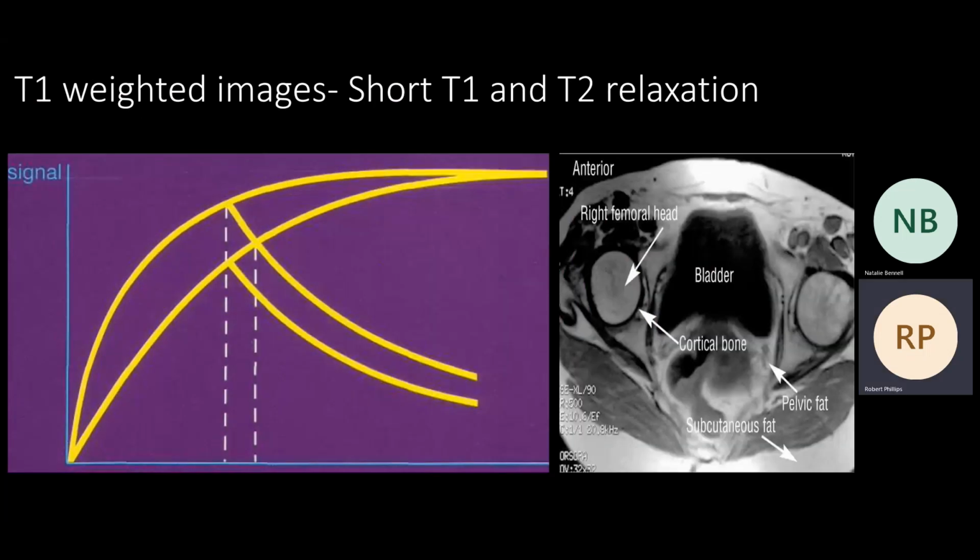On the other hand, when we take an image at this stage, where T1 differentiation is high compared to T2, it's called a T1 weighted image. So what I'm trying to say is that a T1 weighted image also has a T2 component. It's only that the intensity is low. So we can take the image from here. It is completely T1 weighted without T2. So we can ask the computer to take what kind of image we really want.